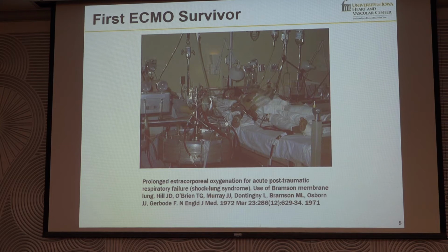Why can't we take that same concept and apply it to bedside management of patients that are in severe cardiac failure or severe respiratory failure? This particular patient was a trauma patient in a car accident, I believe, and he was basically going to die, and they said, okay, let's give this a shot.